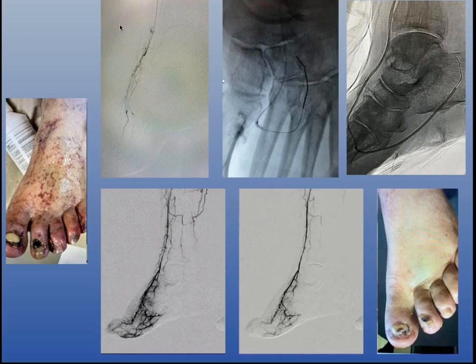And in this case, I was able to do a direct revascularization because I recanalized and opened up the anterior tibial artery. We had a lot of hibernating vessels in the pedal plantar loop, so we were able to be successful with a good vessel prep and angioplasty. And you can see on the far bottom right that that was the end result, 2 weeks after we had fixed him. So that's an example of direct revascularization because I opened up the blood vessel that was supplying the abnormality of interest directly.